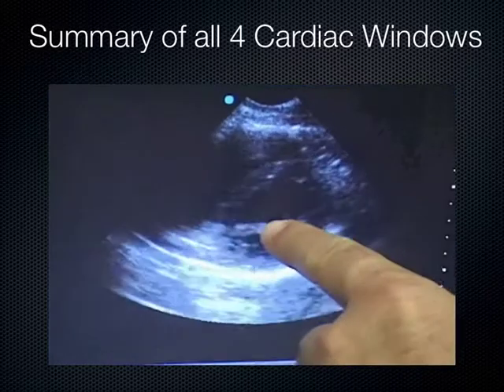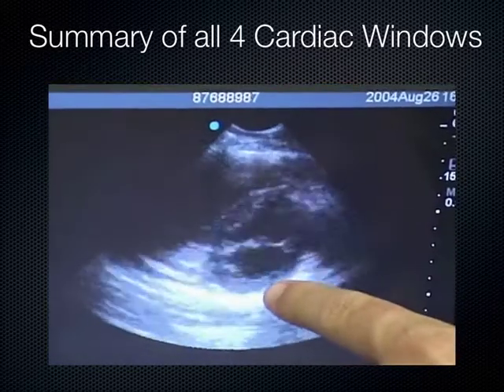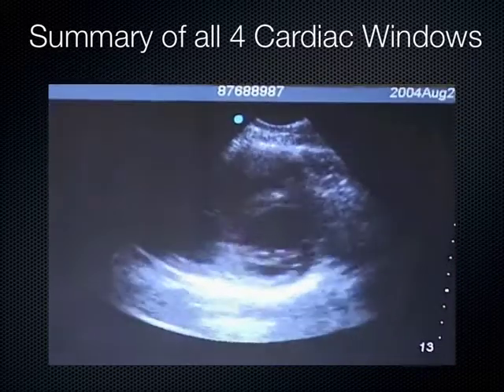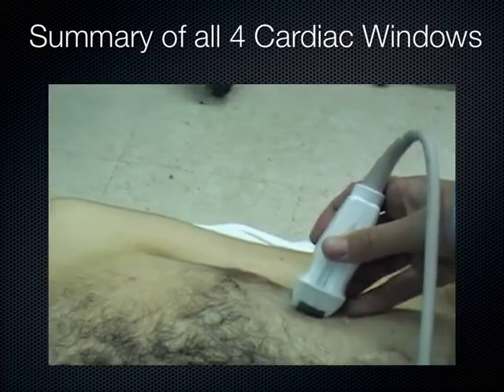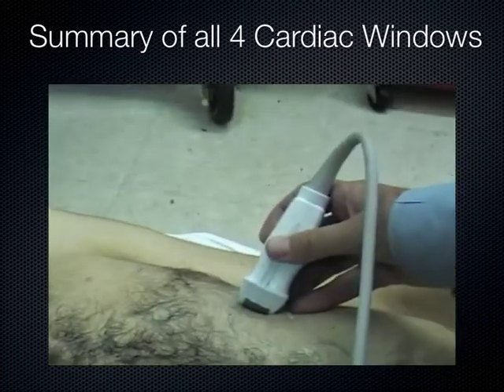So this is the left, this whole thing is the left ventricle. You can imagine squeezing it together on itself like a donut. And this is the right ventricle up here. Okay. And then the fourth view, you want to have the indicator here towards the patient's right again.